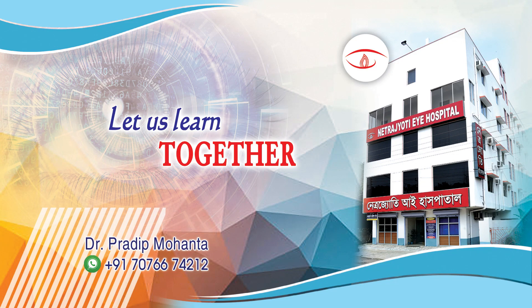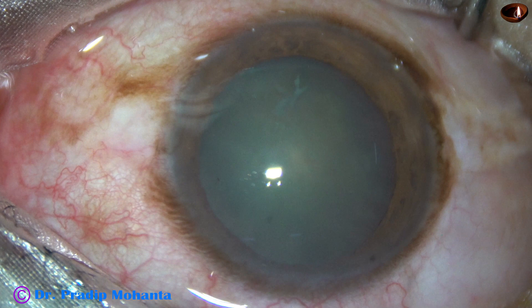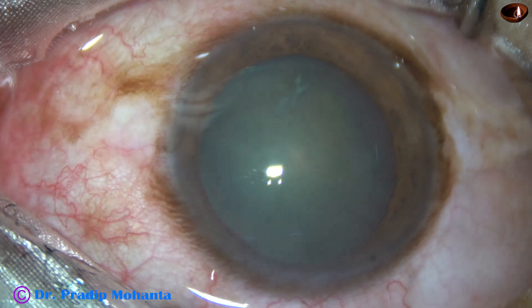Welcome to my workplace at Ranaghat, West Bengal, India. This is a cataract with grade 3 nuclear sclerosis. Let us observe this surgery.